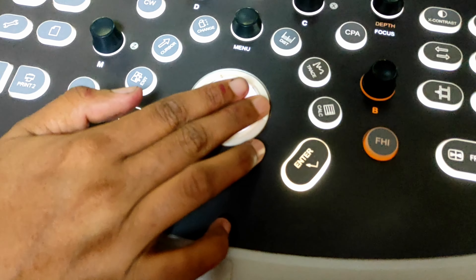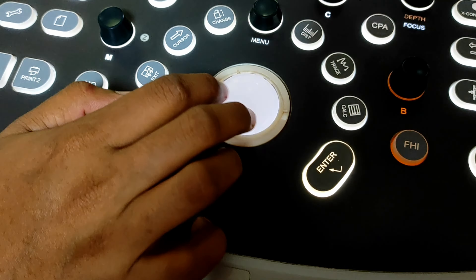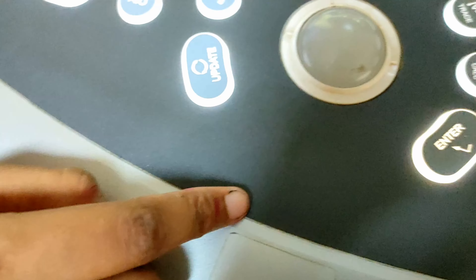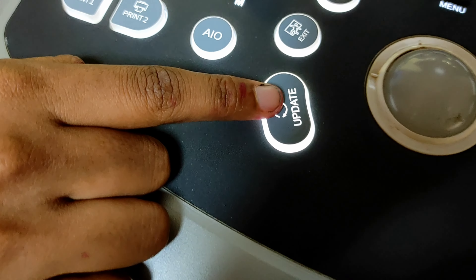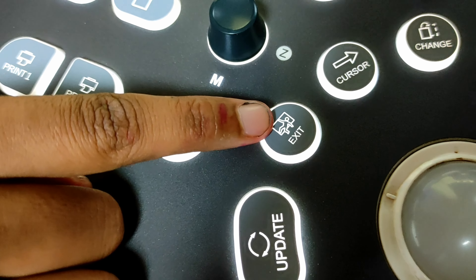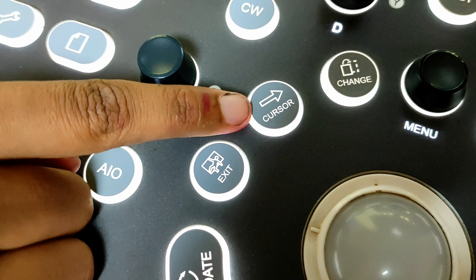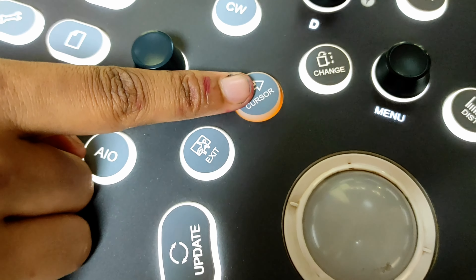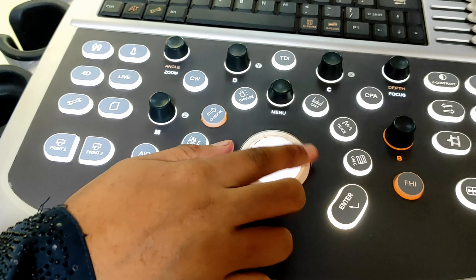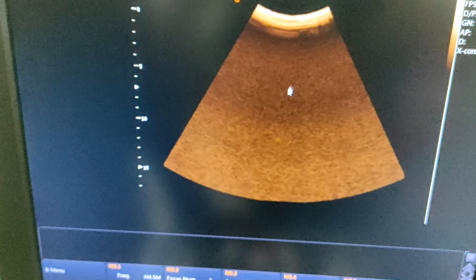This one is the mouse button. And this one is the enter button, or OK button, or set button. This one is the update button. This one is the exit button. This one is the cursor button. You can press it and see on your screen — your cursor is moving. You can use it with your mouse button.